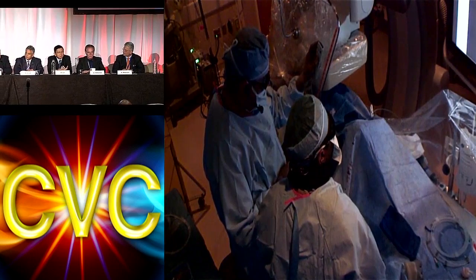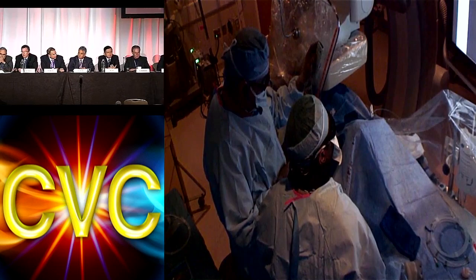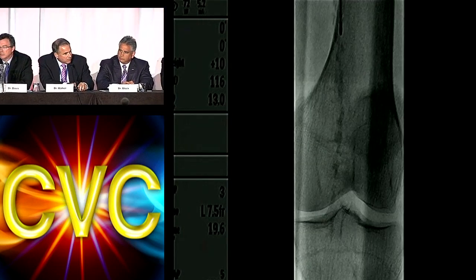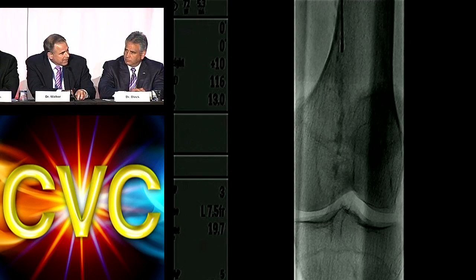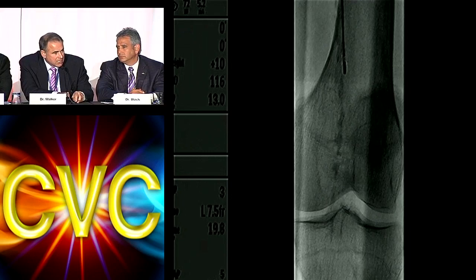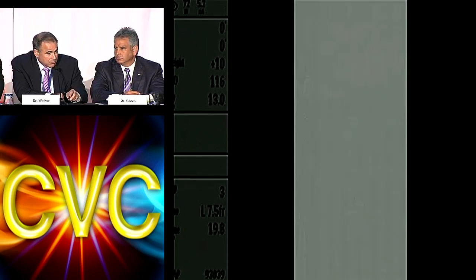In looking at how much calcium I see there, I would approach this with an 18 thousandths, 30-gram tip, sharp angle, Victory 18 wire. You see how much calcium there is right there? I would come off the roadmap, and I would use my calcium as my roadmap. And I think you could potentially get through this. This is densely calcified. Okay. The subtracted shots didn't show it before, but you can see it now.